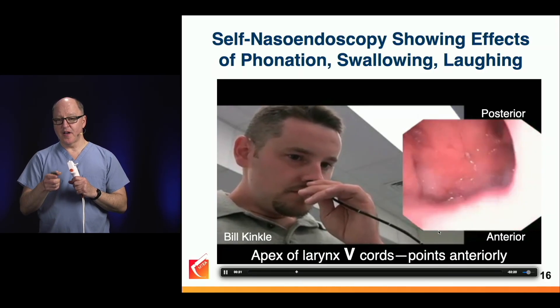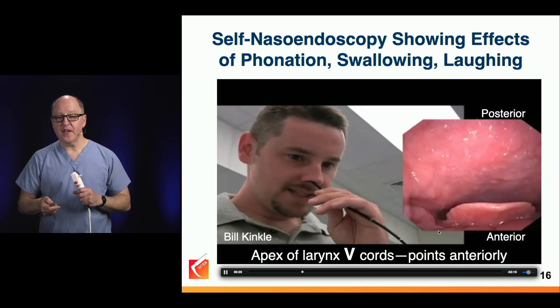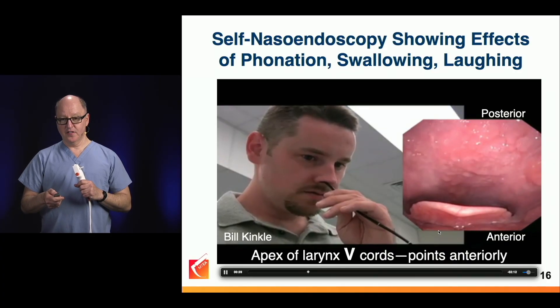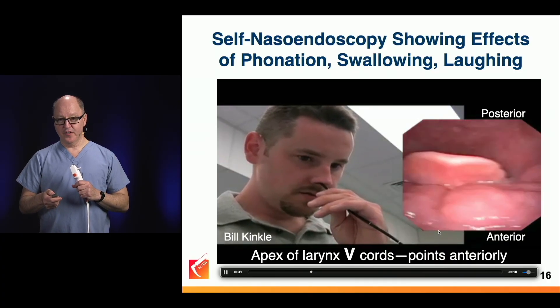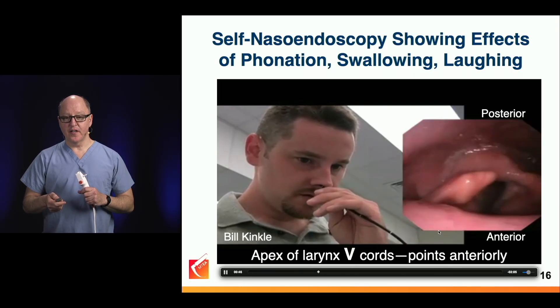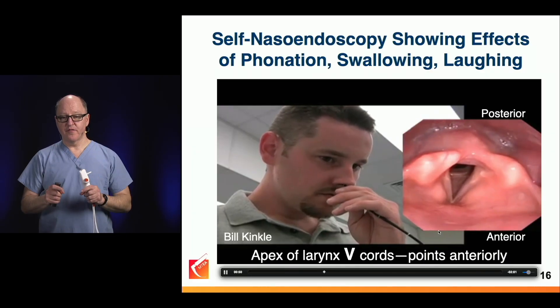And this is what I was saying about getting past the soft tissue ring. So you breathe through the nose — it opens up space. Then you articulate lever down, articulate strong down, and now you get this view. And now if you have them breathe through their nose and you start having them phonate, you can see the cords come together with phonation.